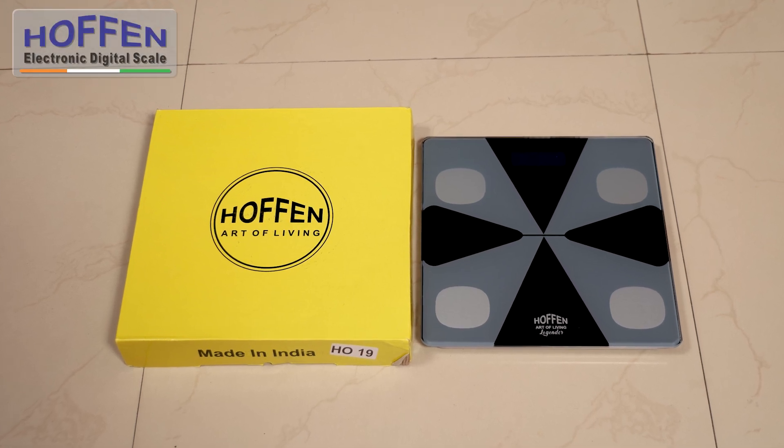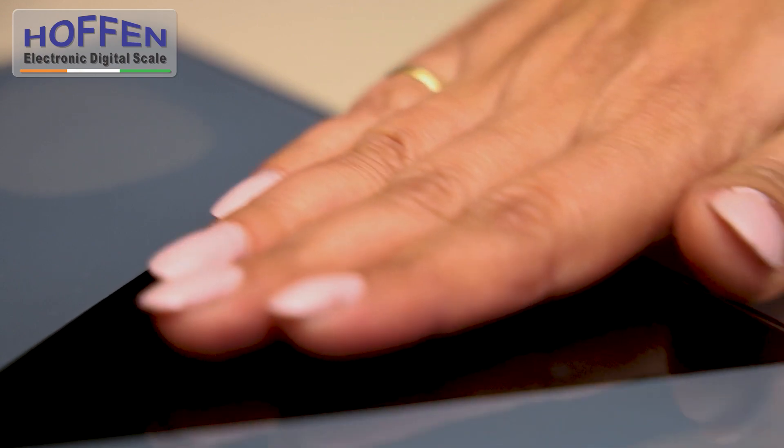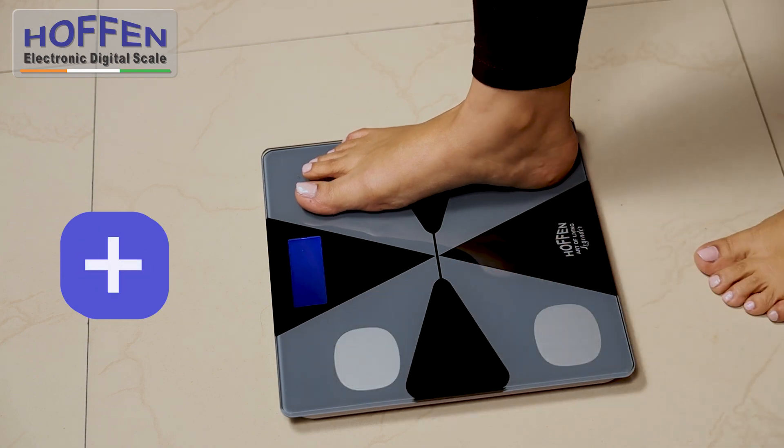Introducing the Made in India Hoffen HO-19 Legender Series — the simple, easy and reliable way to monitor your weight at home, office, gym or a clinic.